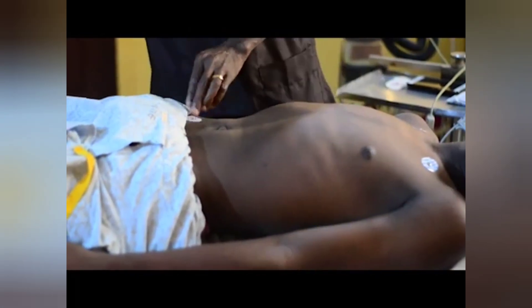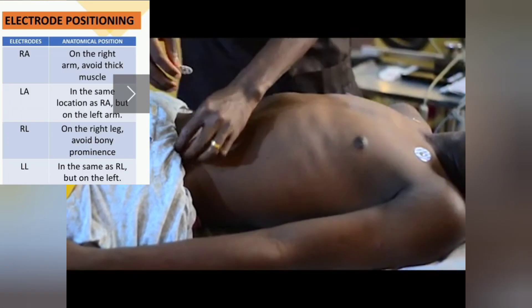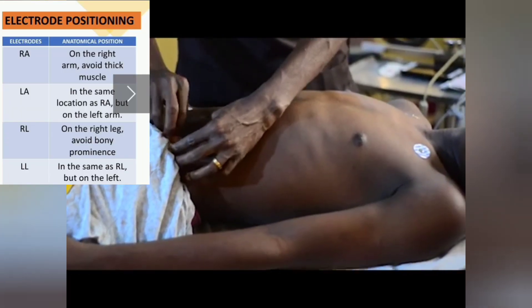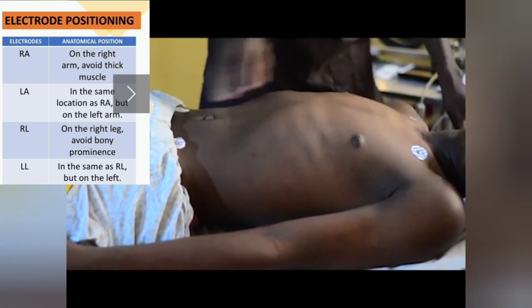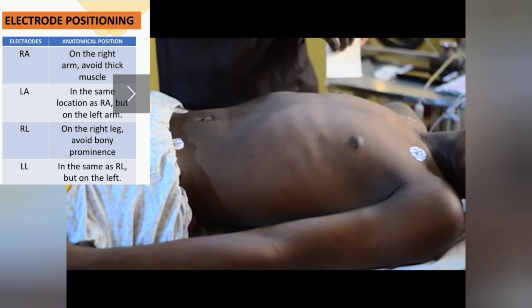For the right leg I will be using the right lower quadrant of the abdomen. You can actually use the leg or any part of it — just avoid bony prominences and areas with too much muscle mass. For the left leg I will be using the left lower quadrant of the abdomen as well. That's it for the limb electrodes.